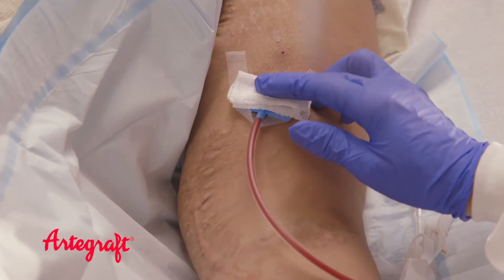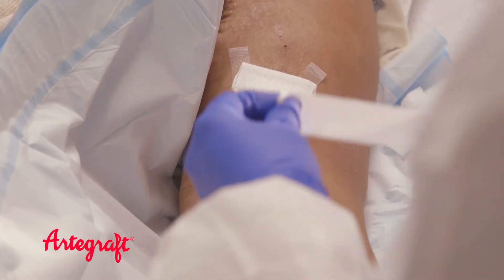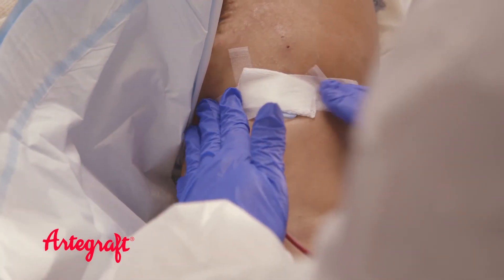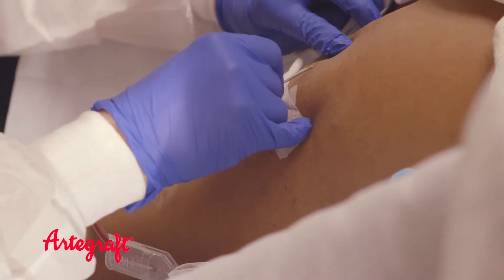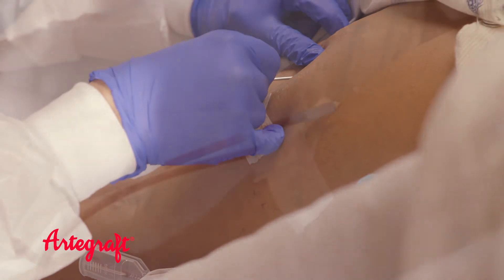Never use clamps, straps, or compression devices such as blood pressure cuffs or tourniquets on the graft. If the graft is not easily distended, you may utilize a tourniquet above the graft — careful not to place it on the graft. Tourniquets must be completely removed once needles are placed.